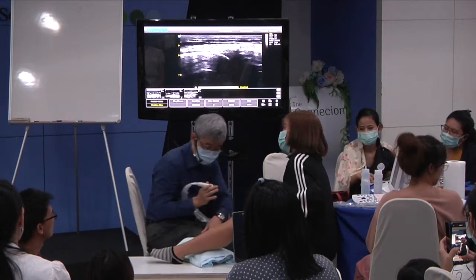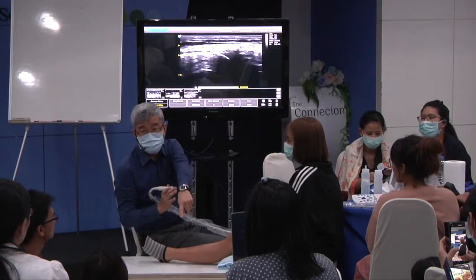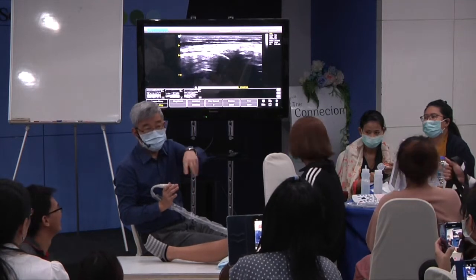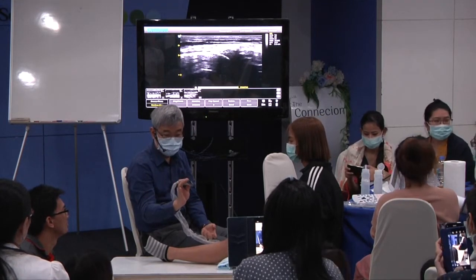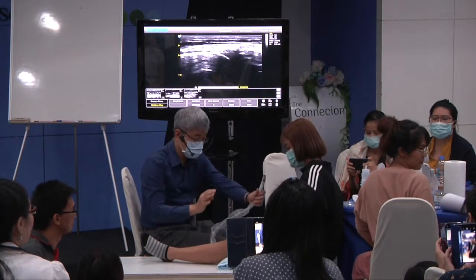Usually I sit here, but if I sit here, most of you cannot see how I place my probe. Can you hold for me? Thank you.